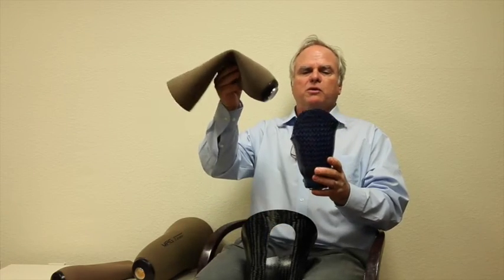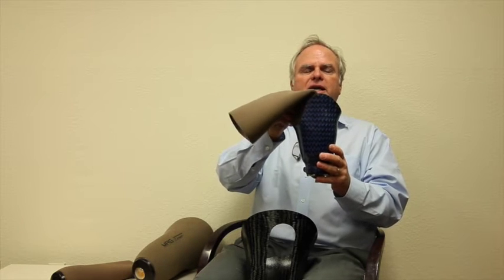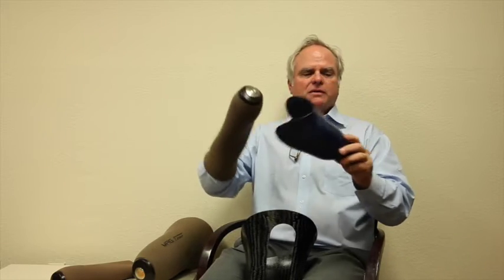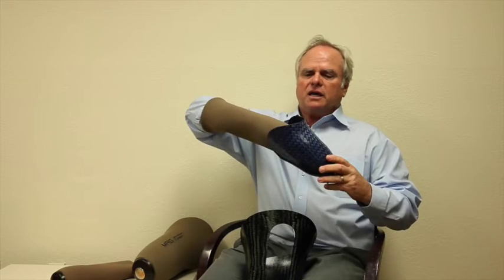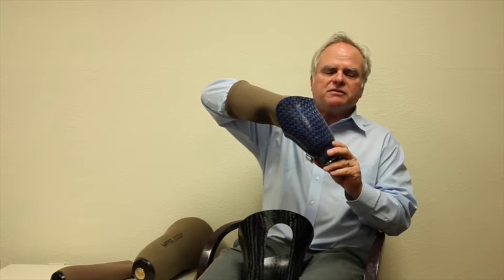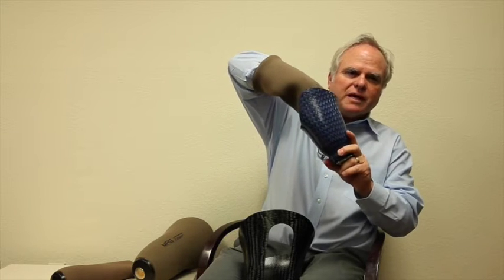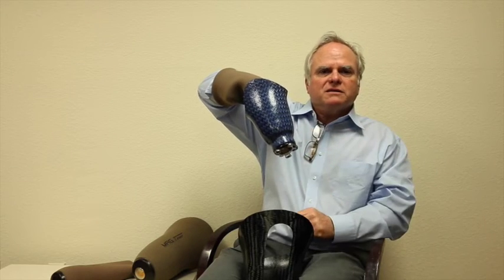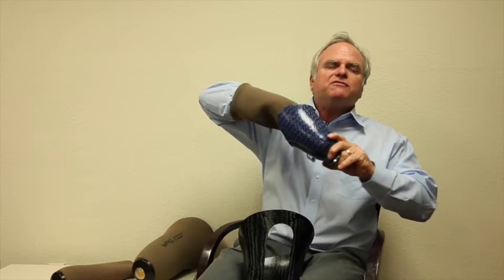The primary reason why people can't find the pin is because when patients put on a below knee amputation socket, they come in at an angle. Let me put this on the lock mode, okay? I'm going to put my hand in here to simulate a leg. A lot of times they'll come in at an angle and they'll hear one click. That's not enough. When they stand up, they hear a second click. And that means it's now flush with the magnet. That now has full suspension.